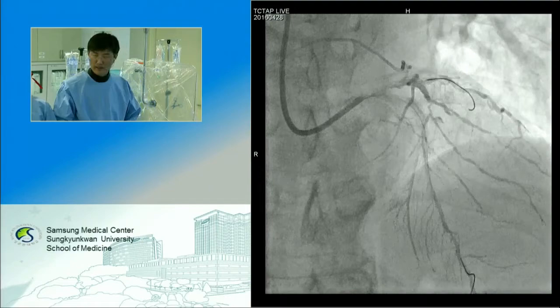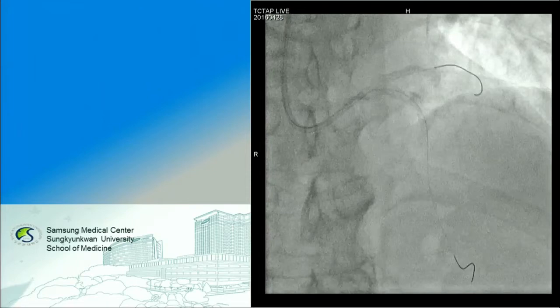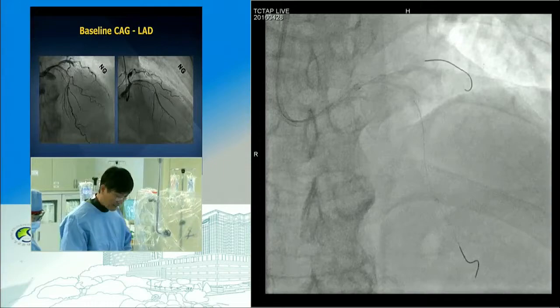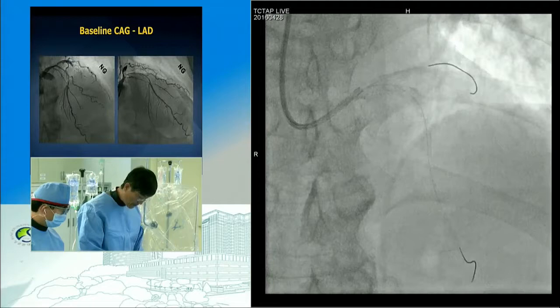So I guess the patient doesn't complain of any symptom, even with the diagnosis. Do you have chest pain? He has no chest pain. Bleeding is not a big deal, right? Yes, I guess so. Right. Not a good image. It's the 3.0, 15 millimeter NC Euphora balloon. I hope this will not perforate, rupture.